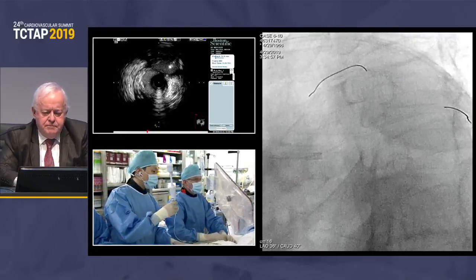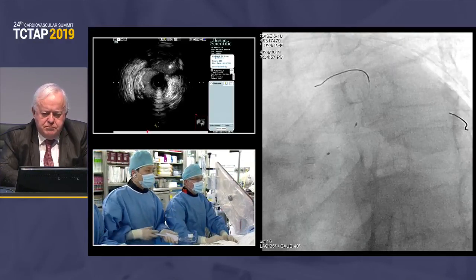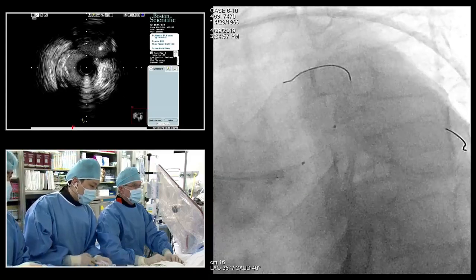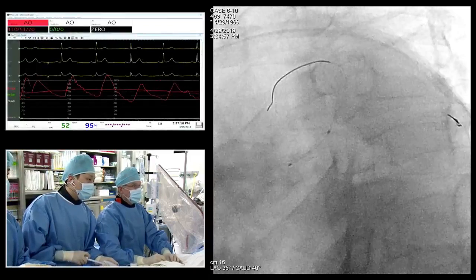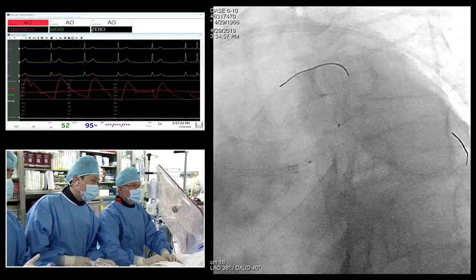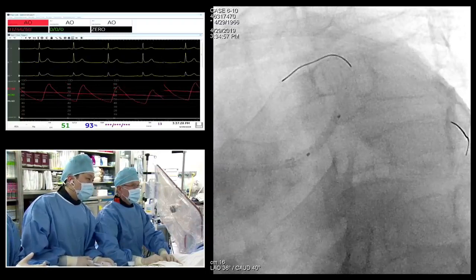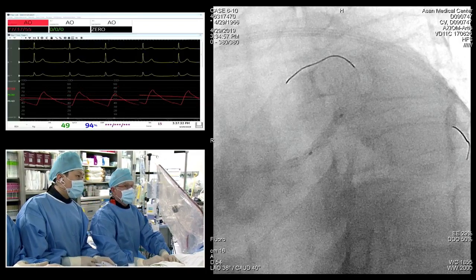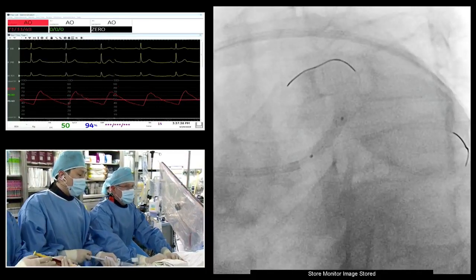So this is a 3.5 NC balloon, 15 in length, small test. Okay, I think we can inflate. Inflate, nominal. Oh, wait. Okay, just try inflate a little bit slow. Okay, it's fine. Go to 20. 20. Okay. Stay up. Okay, deflate.